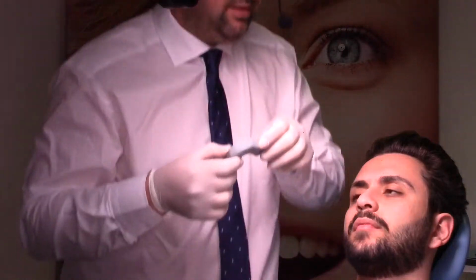And you took the impression on the model with heavy and light. Yes, heavy and light, to be much more precise. And you do all this arcade just to remove the excess of the material after. Yes, exactly, to have a beautiful zenith of the teeth. Okay, good luck. Okay, thank you.